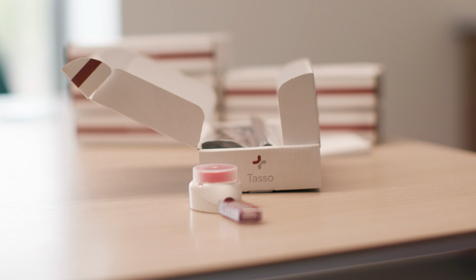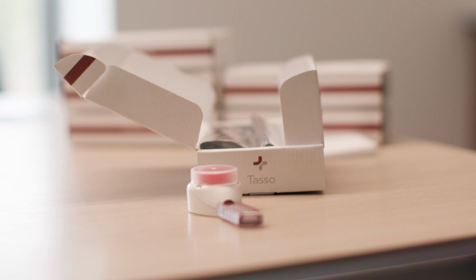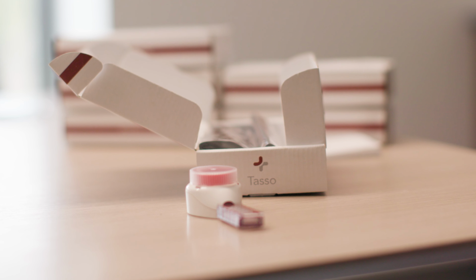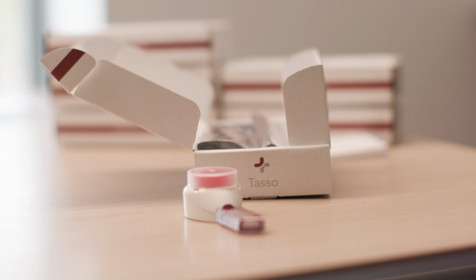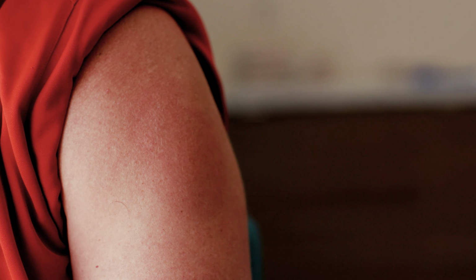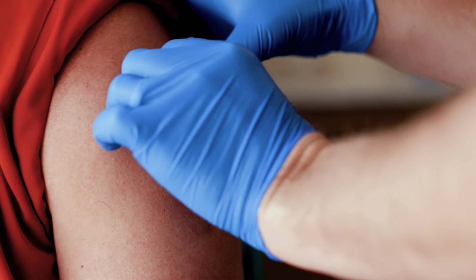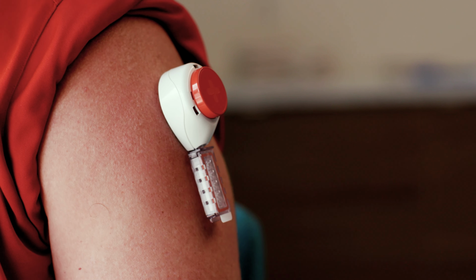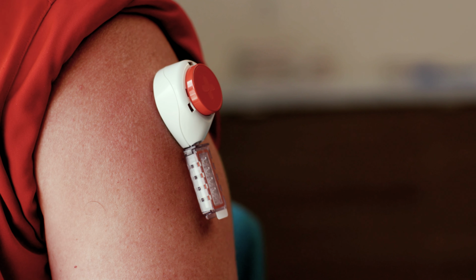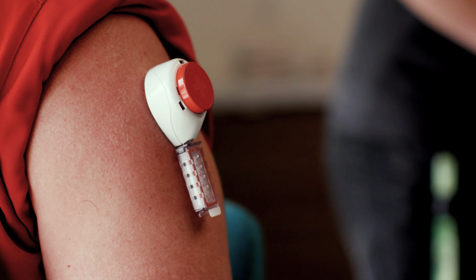Interestingly, the success of DBS also couldn't be realized without collaborators in the industry. Therefore, the anti-doping community has worked closely with a startup company called Tasso, who developed a reliable and safe DBS collection device for clinical medicine applications. The Tasso collection device sticks directly to the skin on the upper arm, and with the literal push of a button, painlessly pierces the surface of the skin to collect a micro volume of capillary blood for testing, capturing the blood on multiple absorbent pellets in a sealed cartridge.